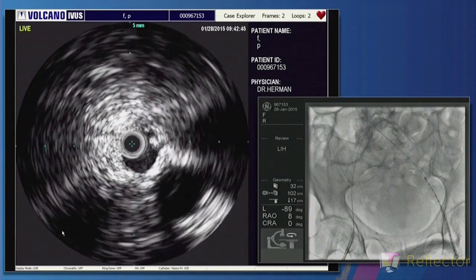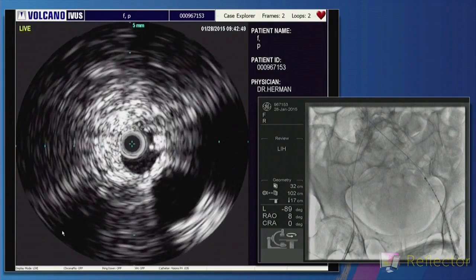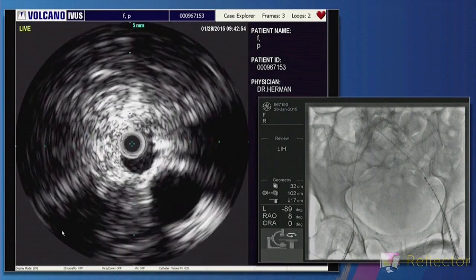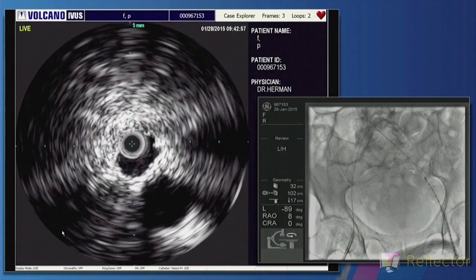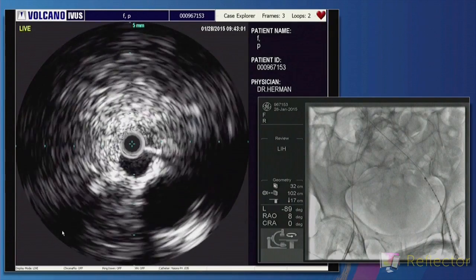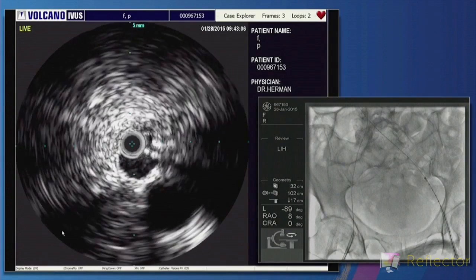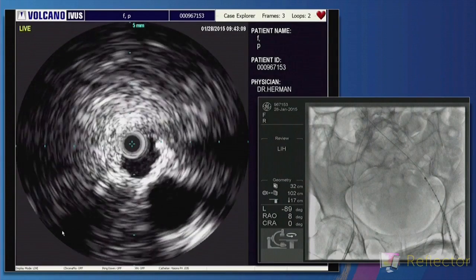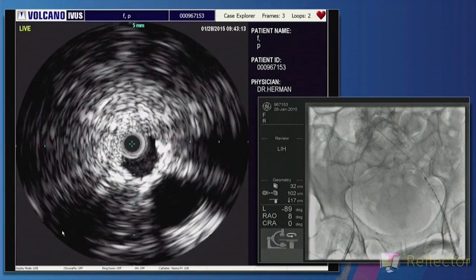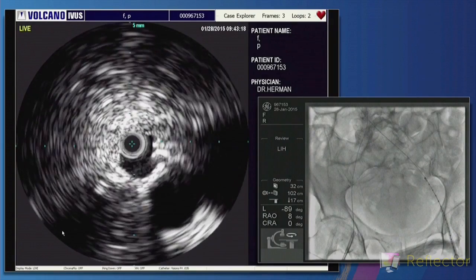Would you do some hemodynamics? We have a ratty here. Yeah, we're ready to go. If anybody can ask him to move his feet while we're looking at this. Okay. Well, we squeeze his calf as well, right? That's also. Squeeze right here. Squeeze hard. All right, squeezing his left calf now with the IVUS catheter in the external iliac. If he can move himself, that would be better, but given the way he's positioned and all that ulceration, it's going to be difficult. Okay. That's okay.